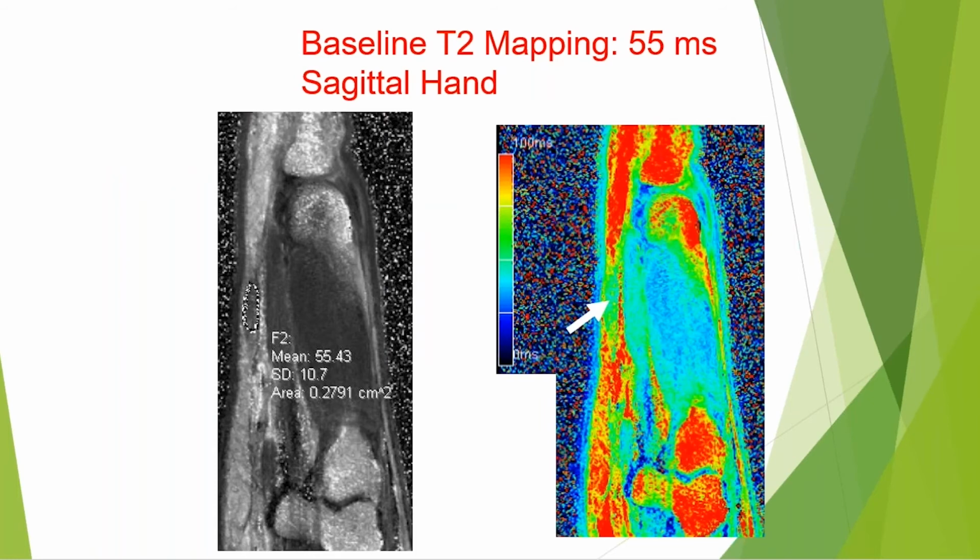And now this shows, on the right of the slide, the T2 mapping gradient, which is very similar to a heat map if you were doing genomics, for instance. And you see the lesion that's on your left is in the greenish area.